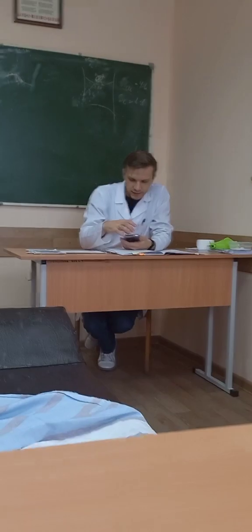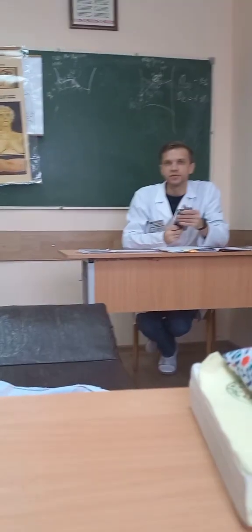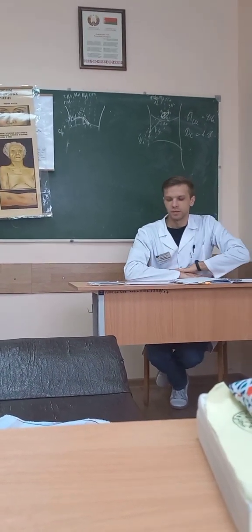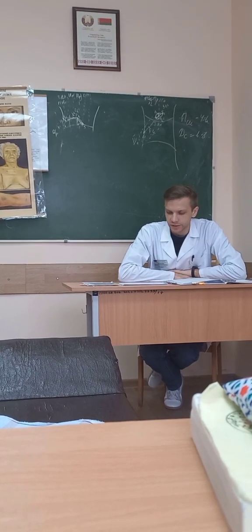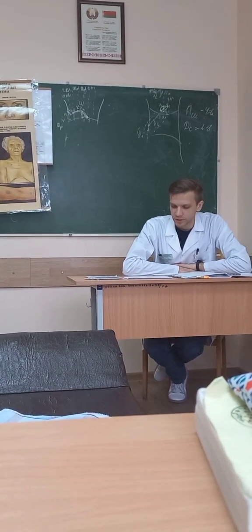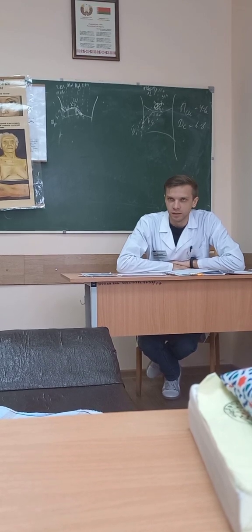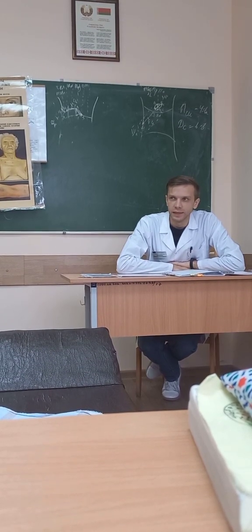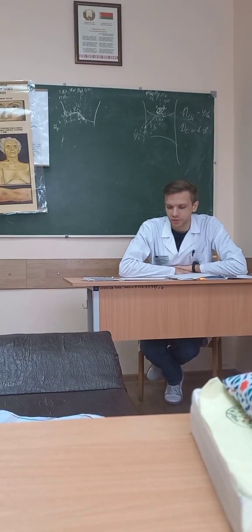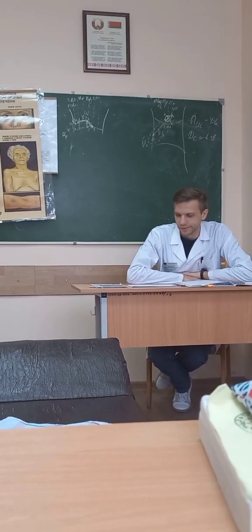When you assess this test, first of all, you have to check presence of some specific symptoms. Look at indicators from muscular fibers up to starch. These connections are connections which show us digestion, digestive function of intestine, pancreas, liver, and other problems.